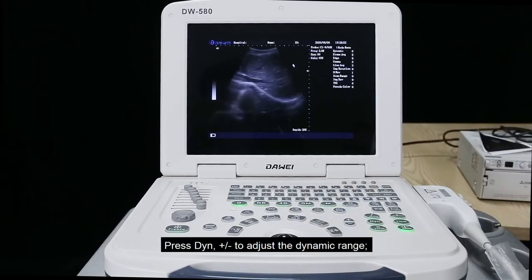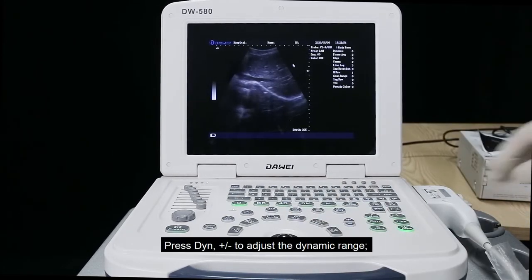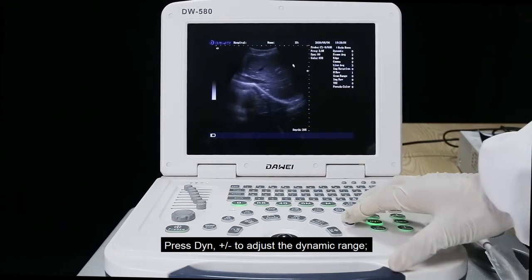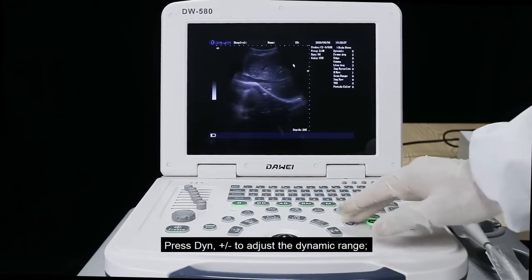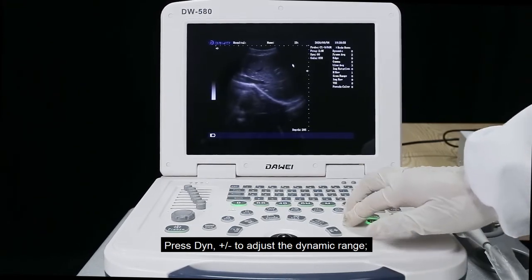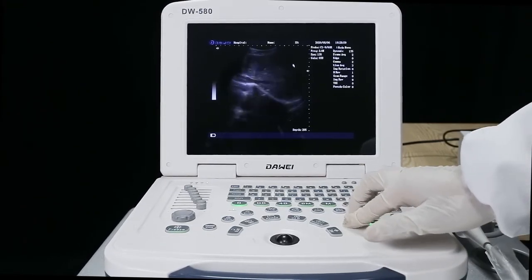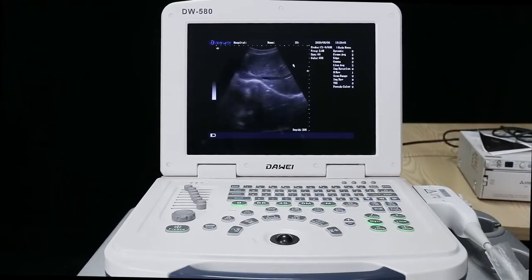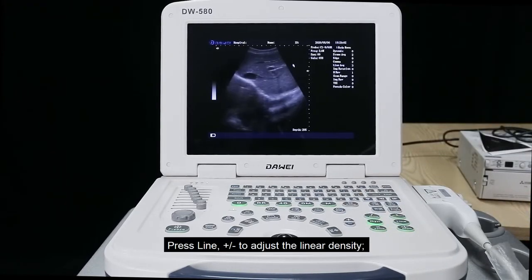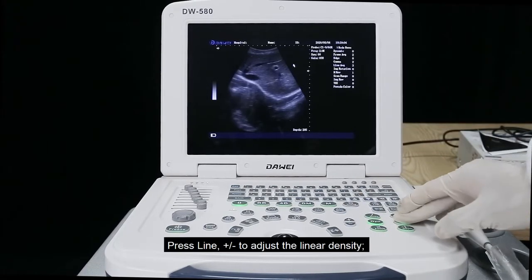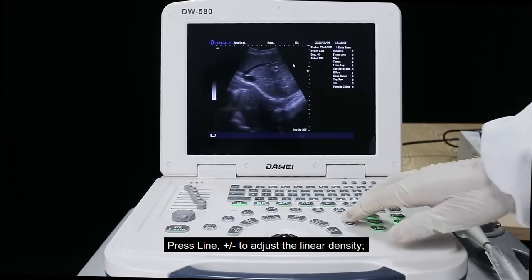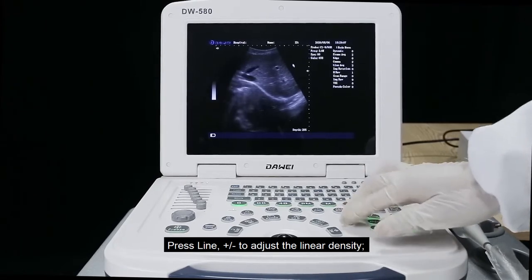Press Dyn plus or minus to adjust the dynamic range. Press line plus or minus to adjust the linear density.